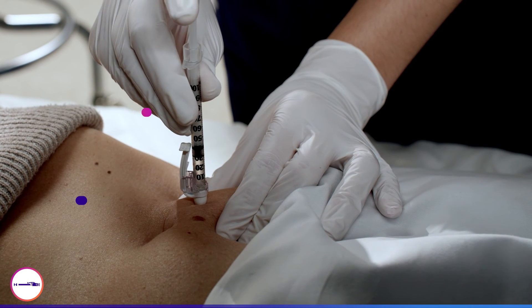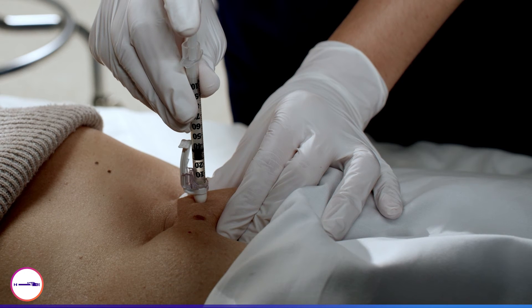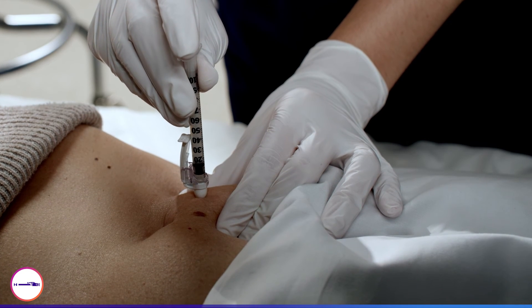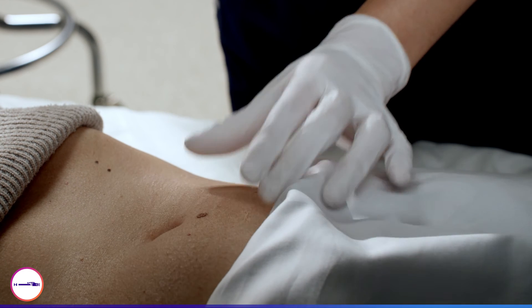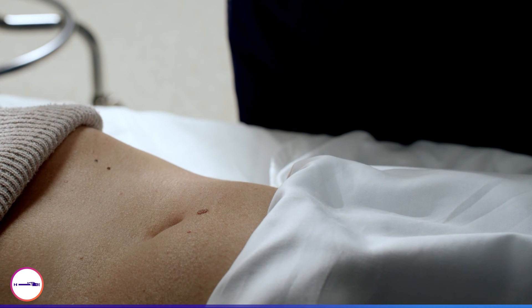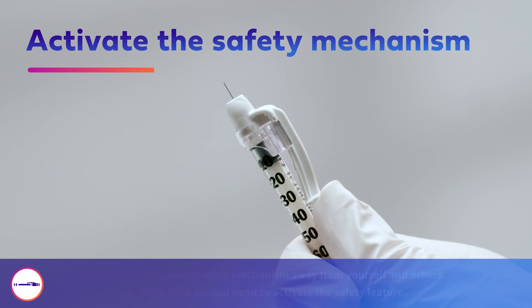Press the plunger slowly and steadily until the insulin is fully injected. Once injection is complete, withdraw the needle from the skin while maintaining a 90 degree angle and release the skin fold.